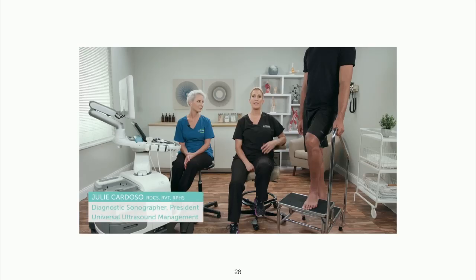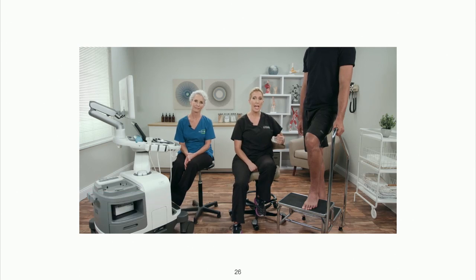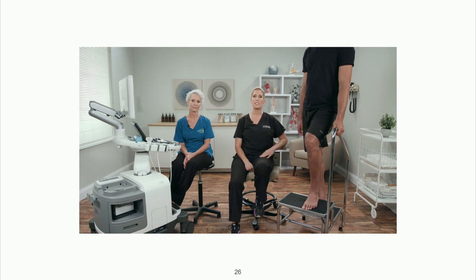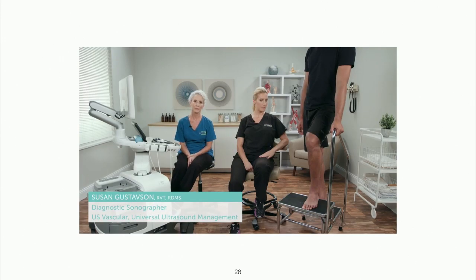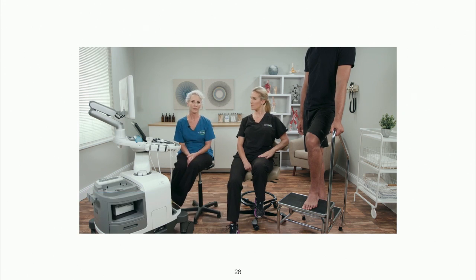Having the patient stand in the upright position will allow us to have a 360-degree view of their lower extremity and also increase hydrostatic pressure to elicit insufficiency of the superficial venous system. One of the best ways to accomplish this is to have your patient standing on a step stool that elevates the limb to the level of your scanning hand and also provides support for the patient to hold on to and stabilize during the exam. Always remember to keep an open line of communication with your patient and explain to them that they may feel dizzy at times, and if needed, they should tell you, and you should allow the patient to sit down and rest for a few moments.